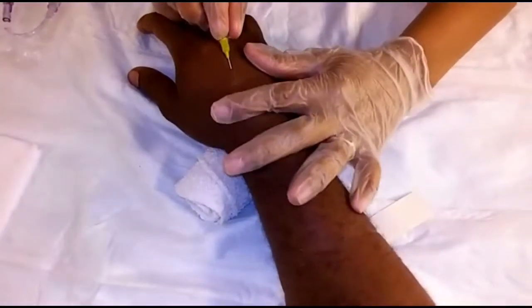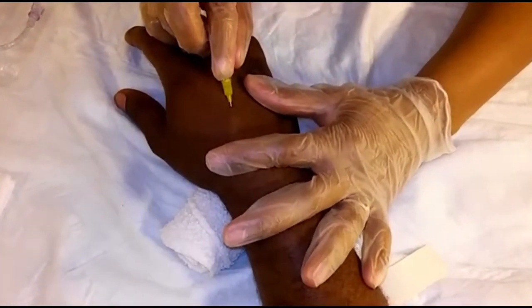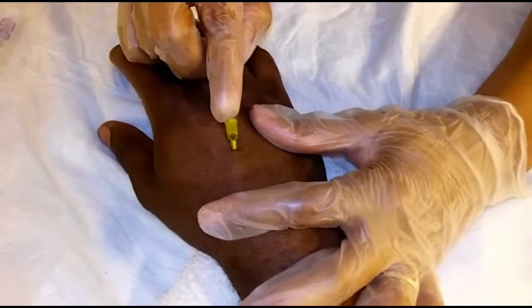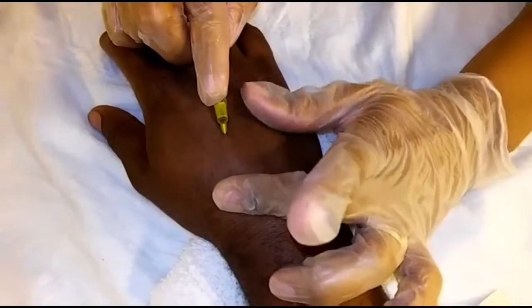Now you want to take the tourniquet off and advance the catheter into the vein. Make sure you place your finger here to apply pressure.